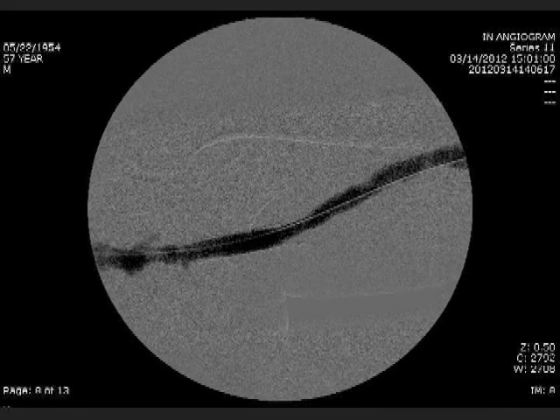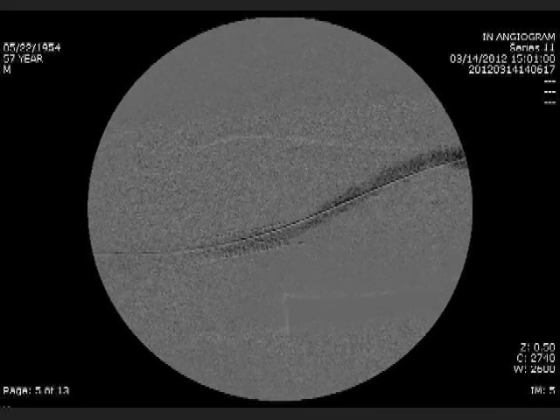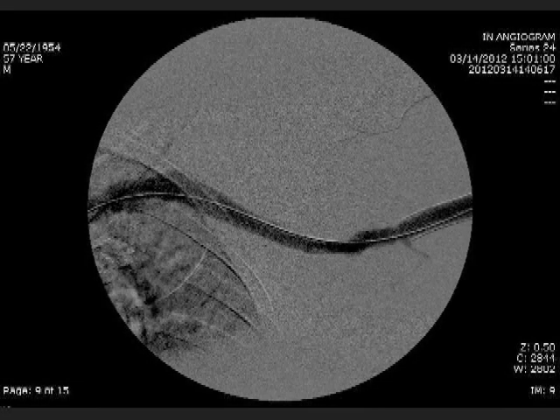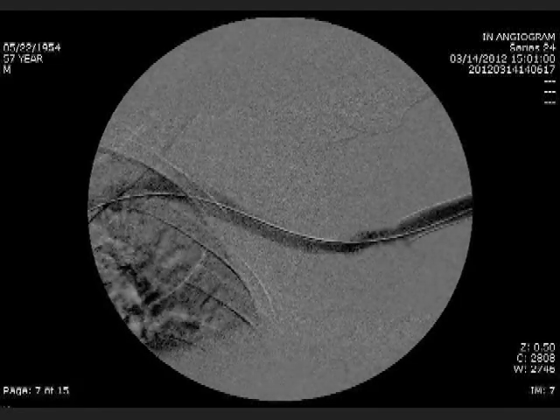As you can see, the post-angioplasty angiogram reveals a significant greater than 50% residual stenosis at the proximal end of the stent. The decision was made to angioplasty the proximal end of the stent with a 12 mm by 4 cm balloon. After the 12 mm by 4 cm balloon, you can see that there is still recurrent stenosis. I chose a Viabahn stent graft. Immediately, the stent migrated proximally into the axillary vein.